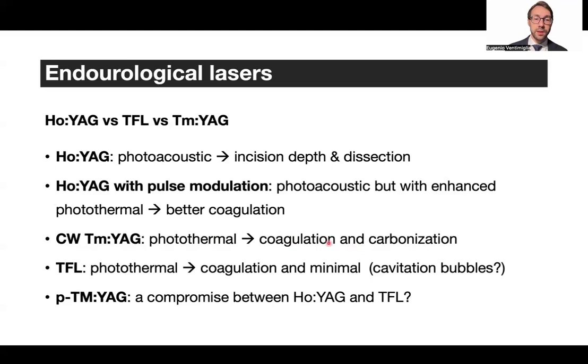Thulium fiber laser works in a pulsated way. It has a photothermal effect with a minimal photoacoustic effect, which is due to smaller cavitation bubbles coming from this laser. And eventually, thulium YAG also works in a pulsated way, meaning that it could be a compromise, or let's say it meets halfway the characteristics of holmium YAG and thulium fiber laser.